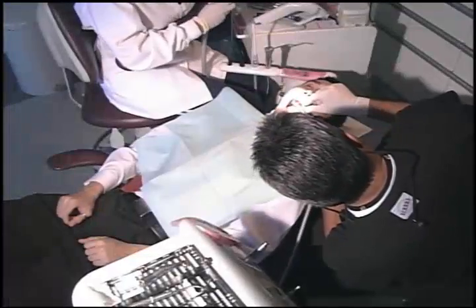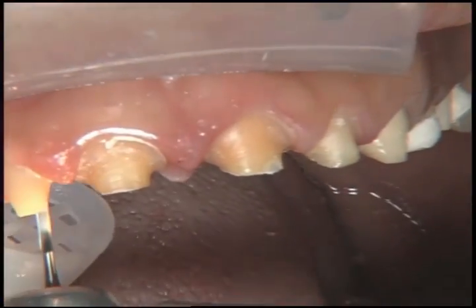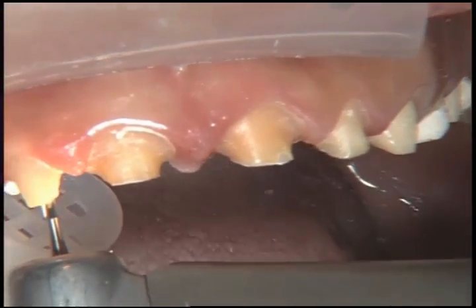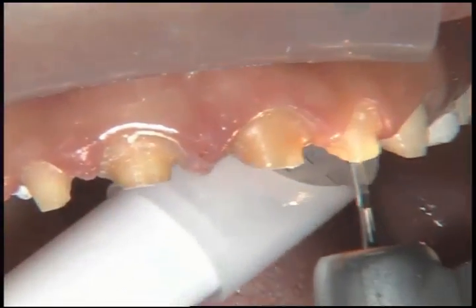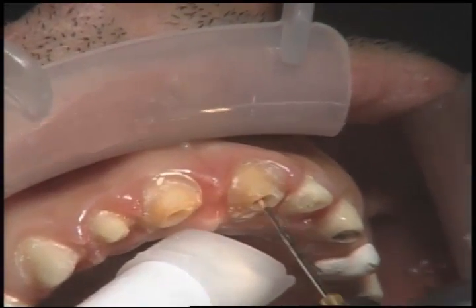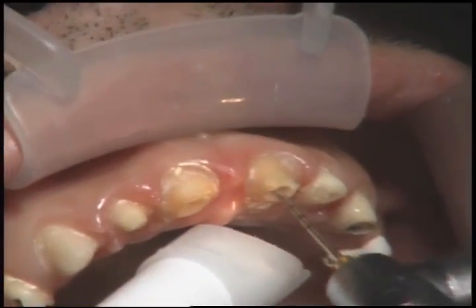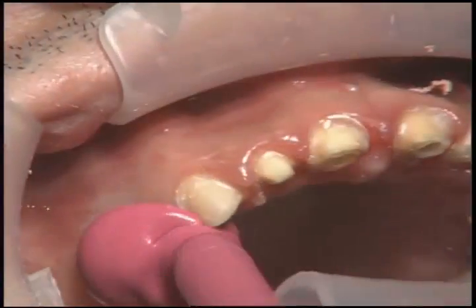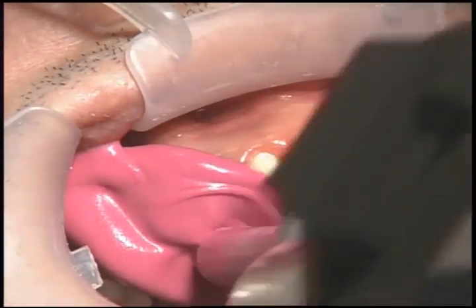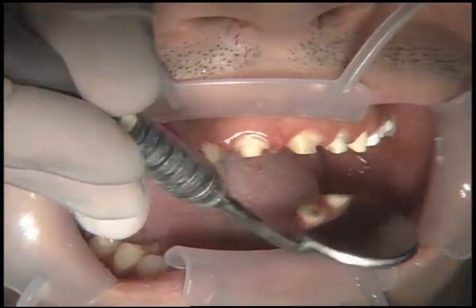The anterior biotemps fell off several times while the patient was awaiting his next appointment, so we decided we probably did not have enough retention on the anterior teeth to help retain the single-unit CapTech crowns that were going to be in place. If they didn't stay in place while they were splinted together, the chances of them staying in place as single-unit crowns was definitely in doubt. So we decided to place post and cores on teeth number 7, 8, 9, and 10.